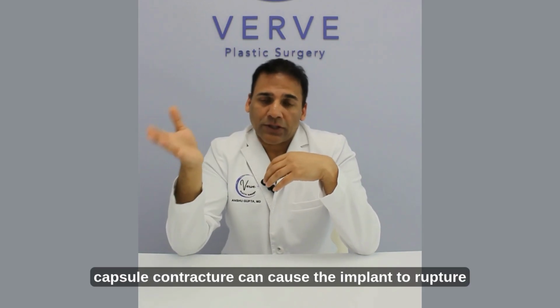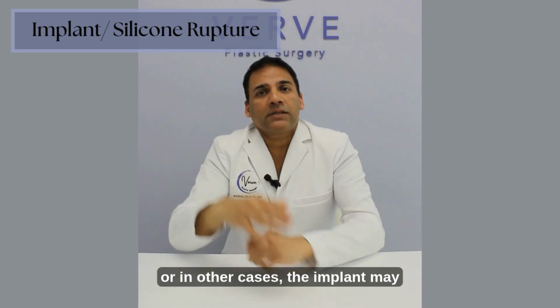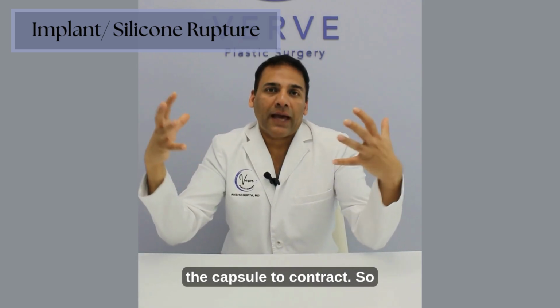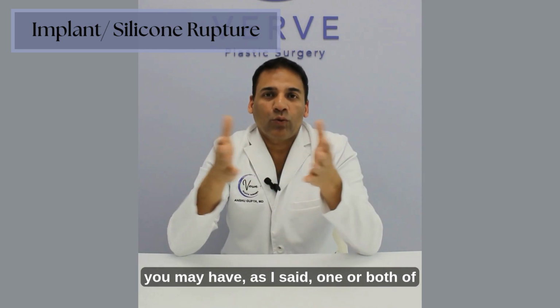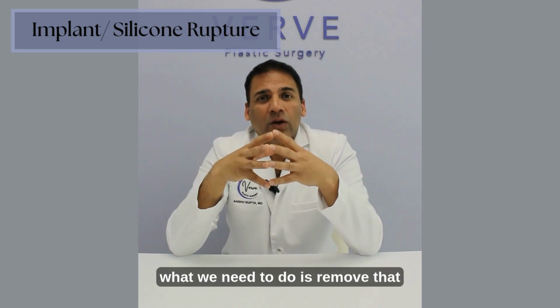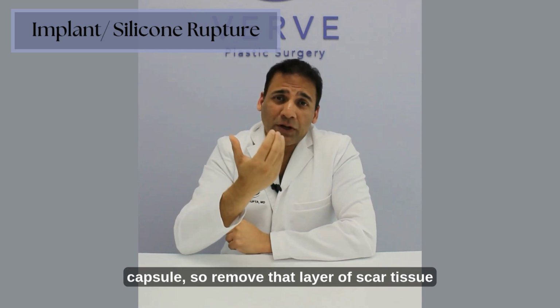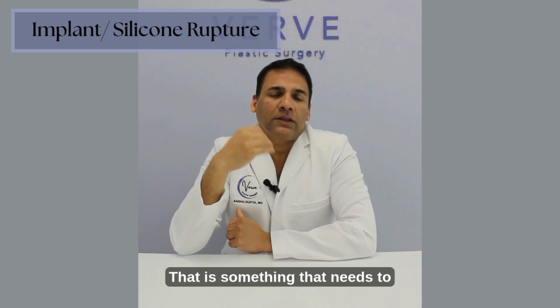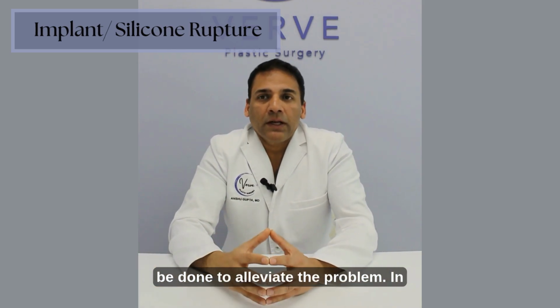Now, capsule contracture can cause the implant to rupture, or in other cases, the implant may rupture, and that may cause the capsule to contract. So you may have, as I said, one or both of these problems, but regardless, what we need to do is remove that capsule, so remove that layer of scar tissue, and remove the old implant. That is something that needs to be done to alleviate the problem.